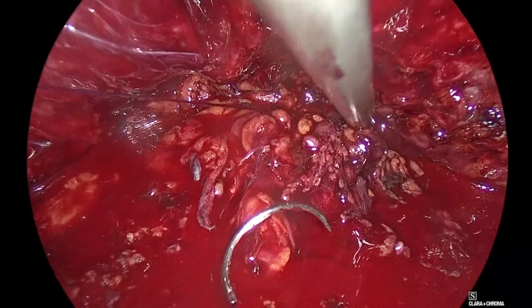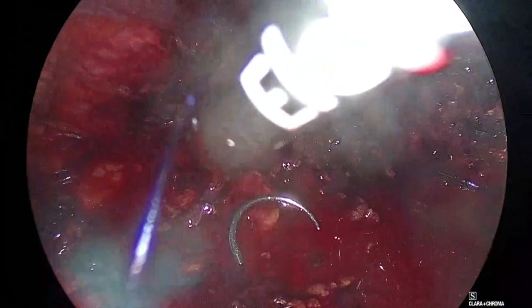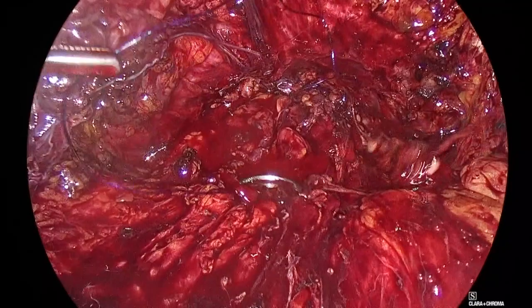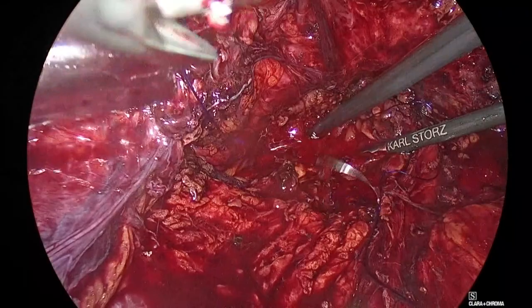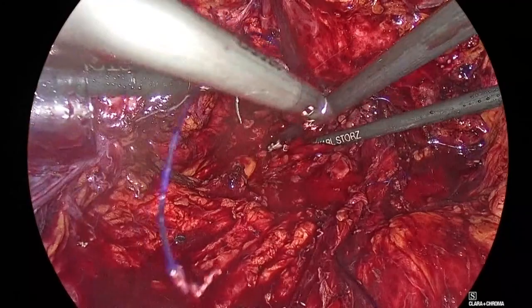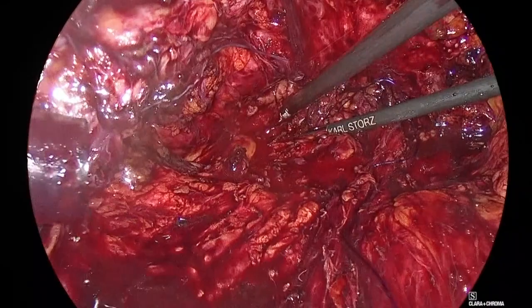Good. Harmonic. Aspirate, Panagiotis. Aspirate, I want to see what this is. Go back, Padeli, go back. Stick the needle out. PDS, I leave the sutures long because PDS is an easy suture to disengage. Let's see it from there. Oops, give me a grasper.